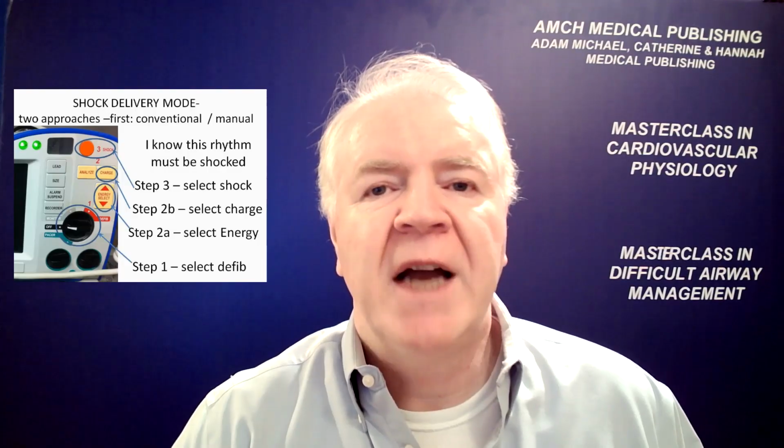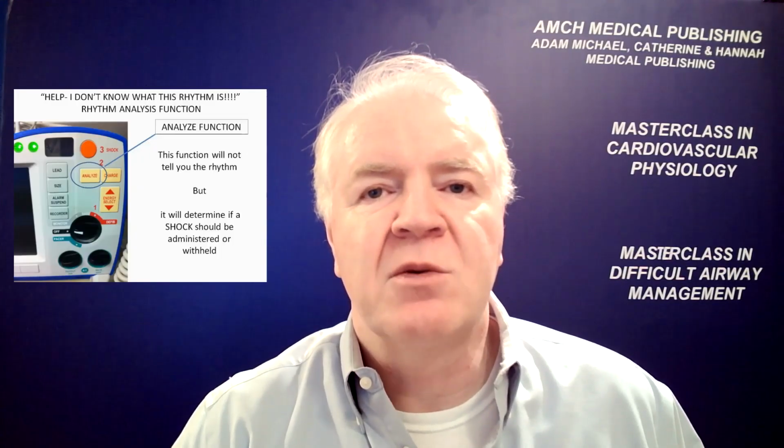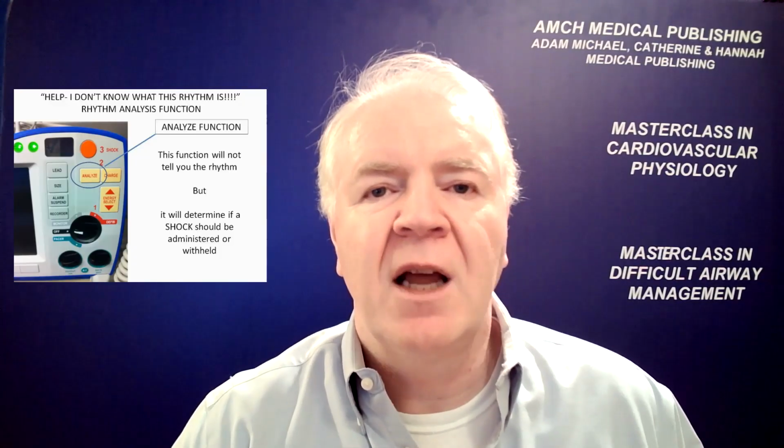Now of course the defibrillator may appear to delay the delivery of the shock. It is only delayed slightly to avoid the upstroke of the T wave and it will be delivered on the very next QRS. Now, most defibrillators can help with the difficult to diagnose rhythms. If you do not recognize the rhythm and you just don't know if the rhythm should be defibrillated or whether it should be cardioverted, then press Analyze.